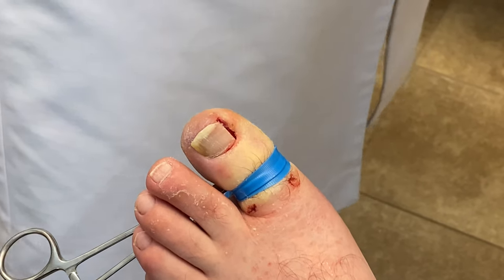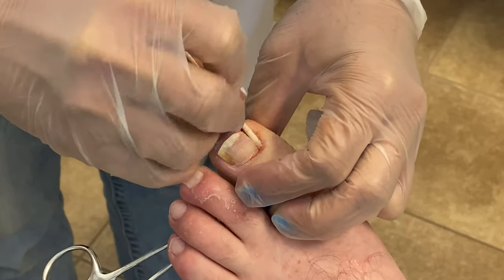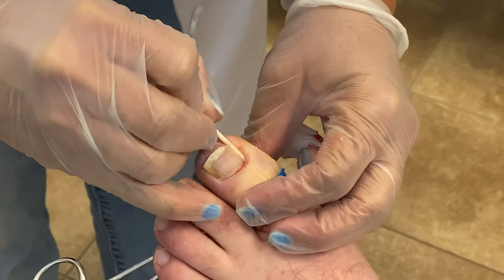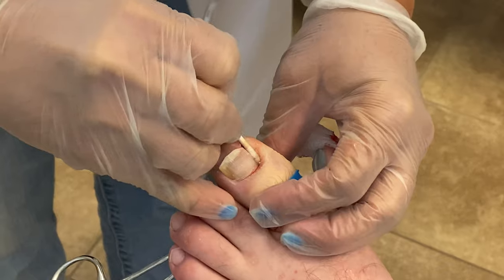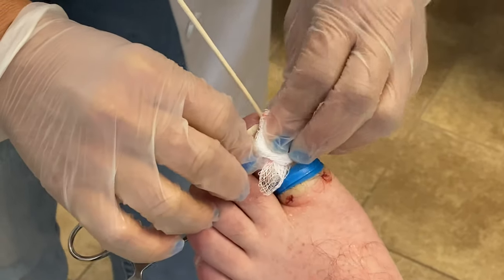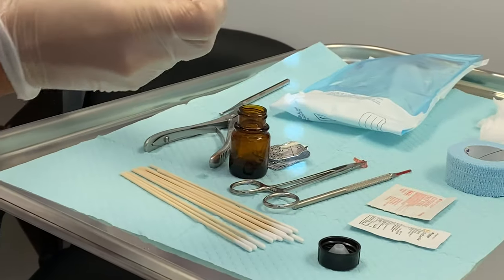The next step is to take a cotton tip applicator that has the acid on it and place it along the matrix where the nail cells grow from. This will allow us to kill the cells so the ingrown toenail will not return. If you skip this step and simply just do an avulsion, then you're at a high risk of that ingrown toenail returning.